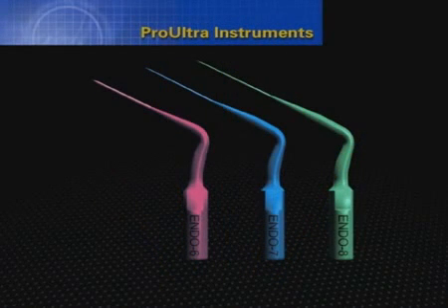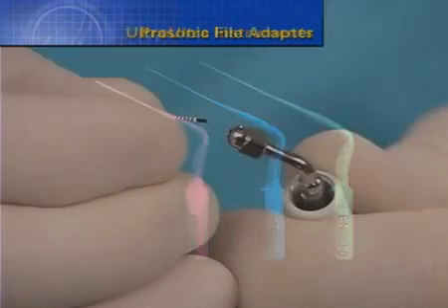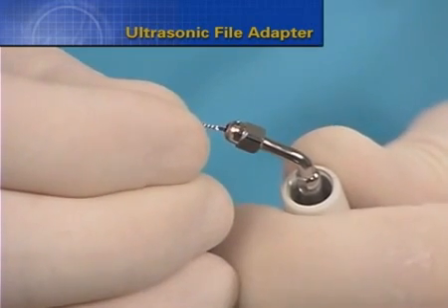As seen in the transportation section earlier in this show, MTA can be gently vibrated, moved into a defect, and adapted to the canal walls with parallel-walled ultrasonic instruments such as the Endo 6, 7, or 8. In this application, these instruments' pointed, most distal ends should be rounded off to prevent marring the internal walls. Direct ultrasonic energy will vibrate and generate a wave-like motion, which facilitates moving and adapting a material like MTA into place.